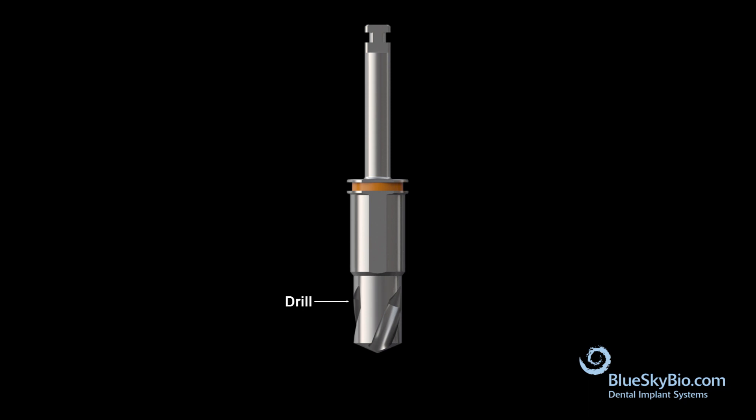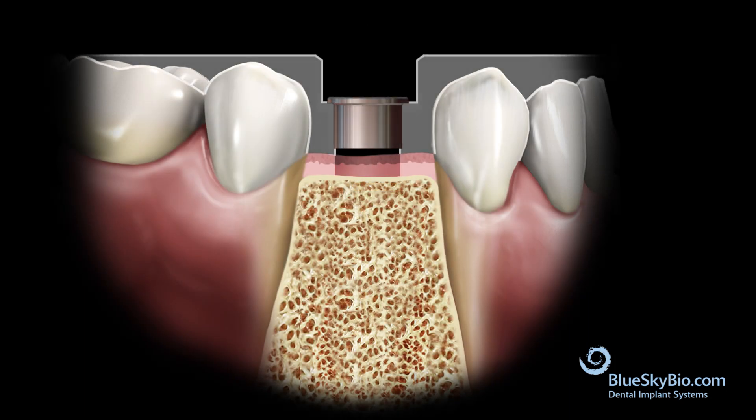the guiding section which precisely fits the guide tube, and the stopping section that prevents the drill from going too deep. Seat the guide in the mouth and insert the drill flat profiler. Activate the drill only after the guiding section has engaged the guide tube to center the drill.